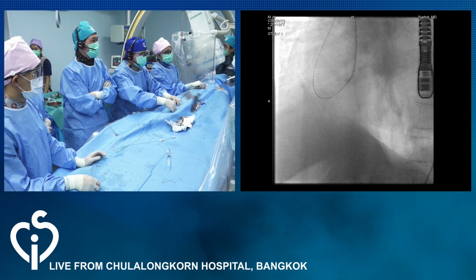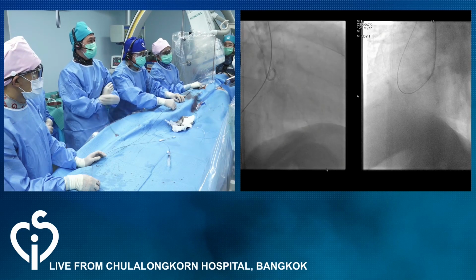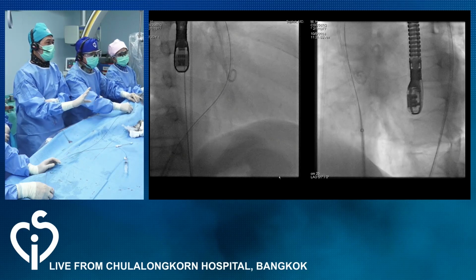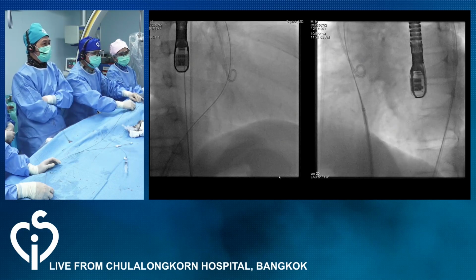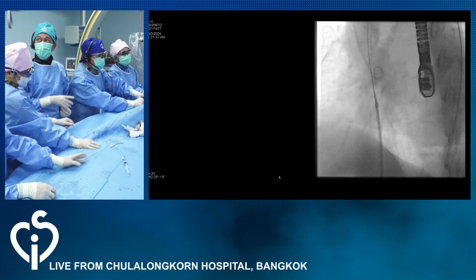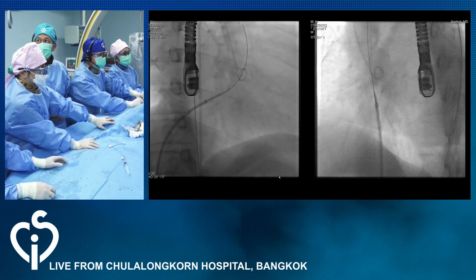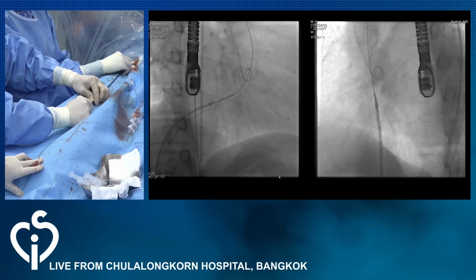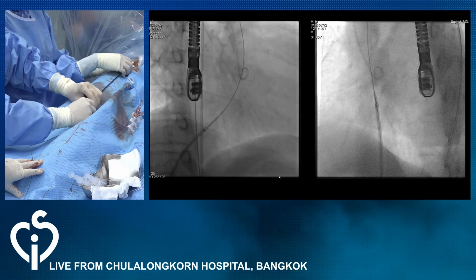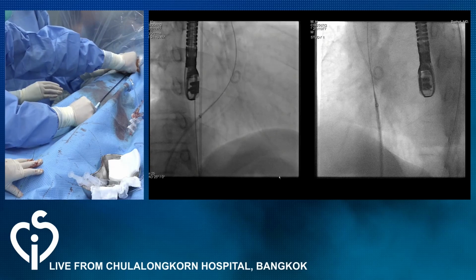ADO1 10/8, 8/6, 6/4. Looks like 10/8, ADO1 seems to be the preferred one.